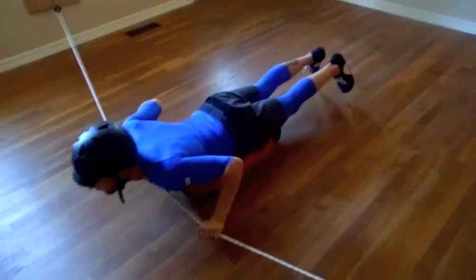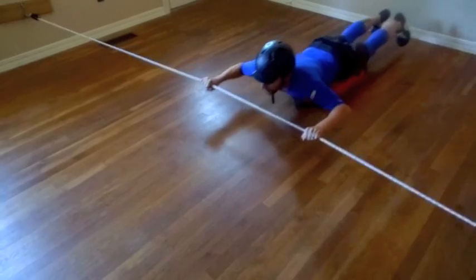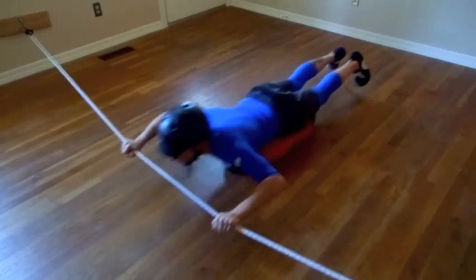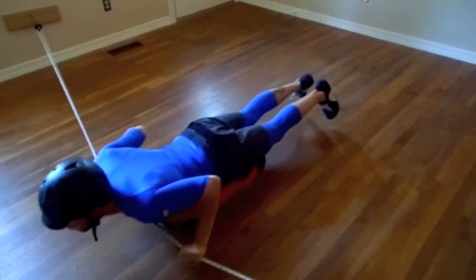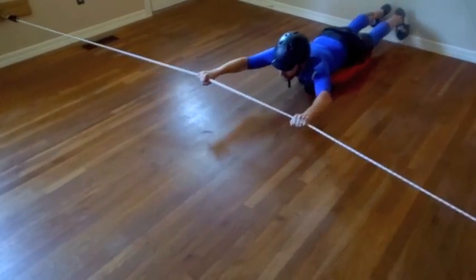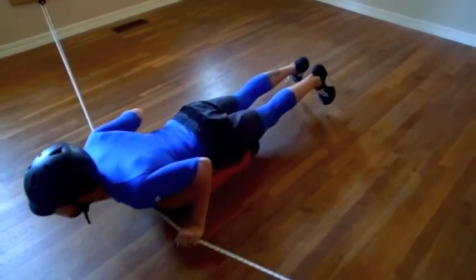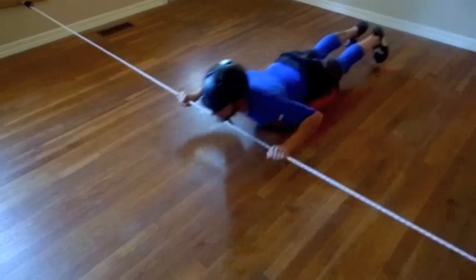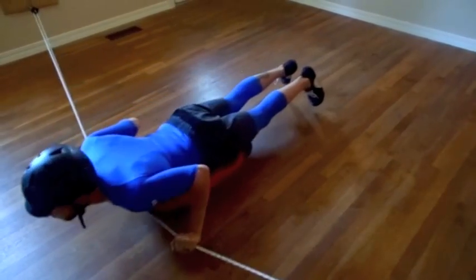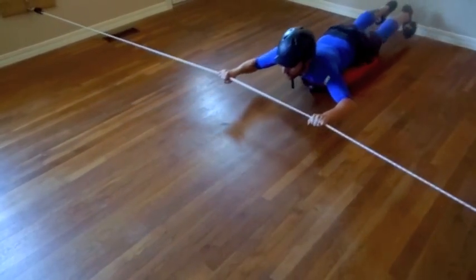Now let's take a look at prone position — linear prone. Have the patient lie down in prone with the trunk on the board and arms and legs extended. Place hands wider than shoulder width apart. The patient will push and pull the bungee with fluid motion without fixing at their trunk. The therapeutic value is promoting and increasing strength and stabilizing prone extension posture, activation of the vestibular system for balance, and lessening gravitational insecurity. To adapt for the Just Right Challenge, downgrade by using a longer scooter board, assist the patient with pushing and pulling on the bungee rope, increase verbal cues, or sing a song for rhythm.